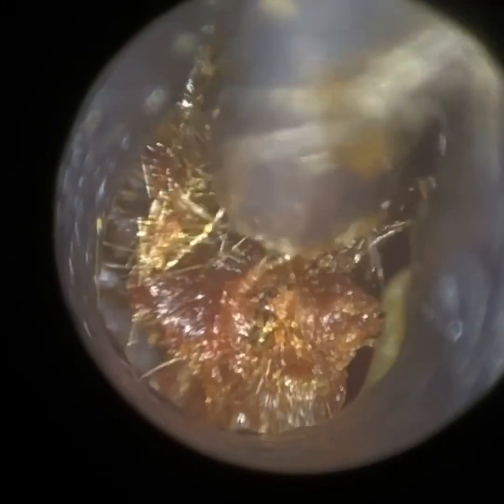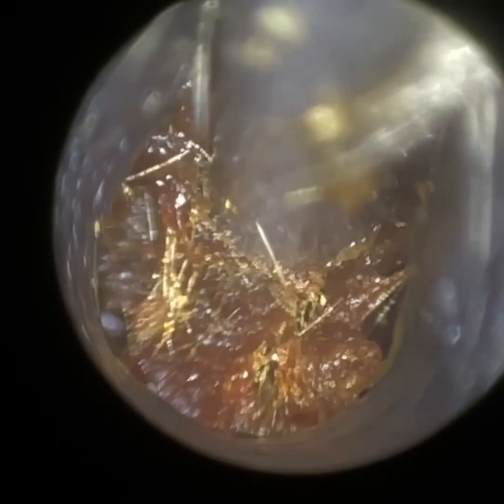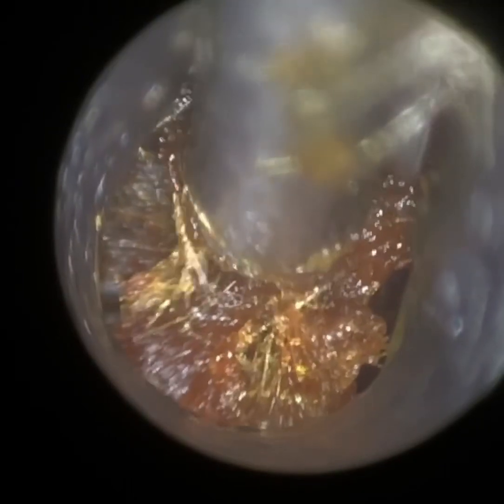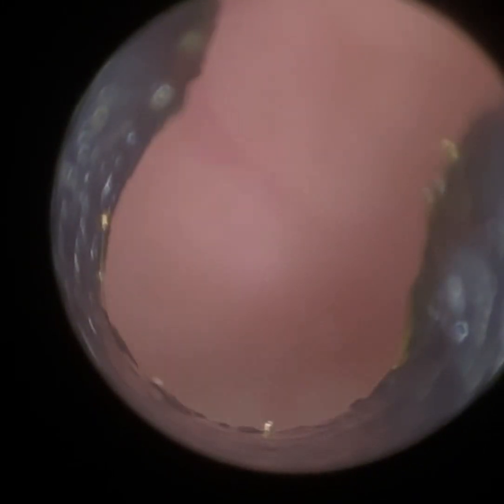Having that slit also helps with additional maneuverability and allows us to use all ENT micro-instruments. You can rotate that slit to your preferential angle — I'm more or less positioning it at 1 o'clock. If you're left-handed you'll probably have it around 11 o'clock; some people may prefer it more at 3 o'clock, more sideways. You can detach it, reattach it, and swivel it as well.